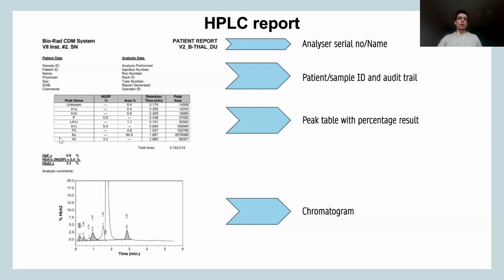It has some provisionally given names, but it always needs to be taken into account that hemoglobins can run in the same position as known fractions that the analyzer gives. So we need to take that into account if you're looking at a more complex result. The table with the values is not sufficient to give an informed decision. We need to look at the chromatography itself to see if it was successful, and visually you'll be able to detect some peaks that, in conjunction with the whole result, could be meaningful for interpretation.